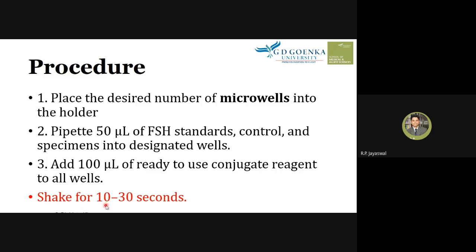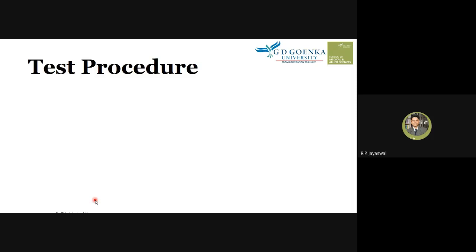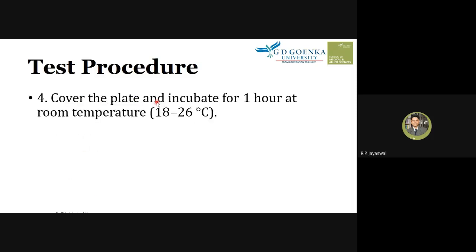Then we need to shake for 10 to 30 seconds. This is very important because this helps to mix properly, and it should be done very gently. Now cover the plate, and incubate for 1 hour at room temperature. After 1 hour, remove the liquid from all wells. Whatever liquid we have kept in the wells, we should discard, right?